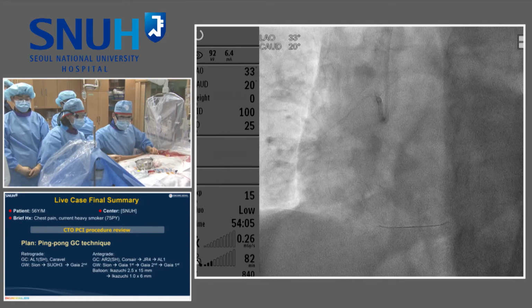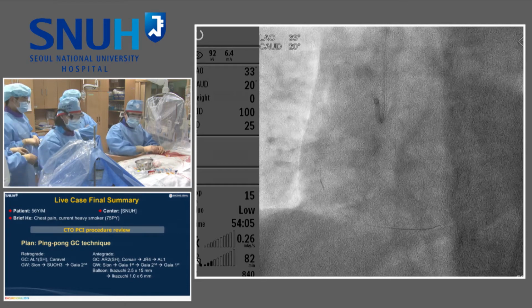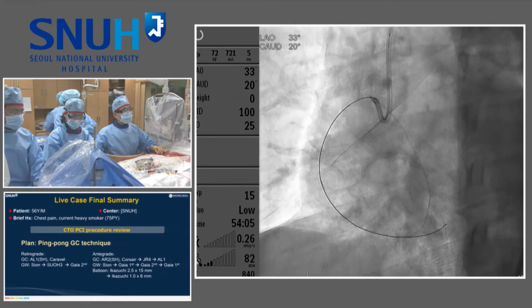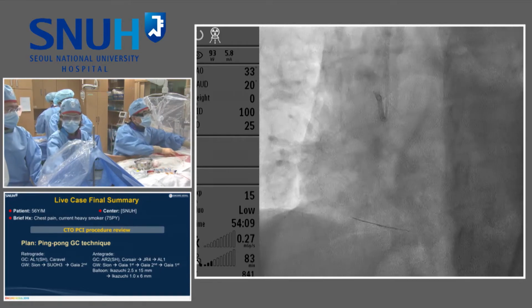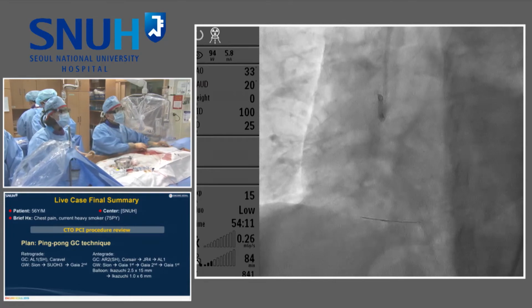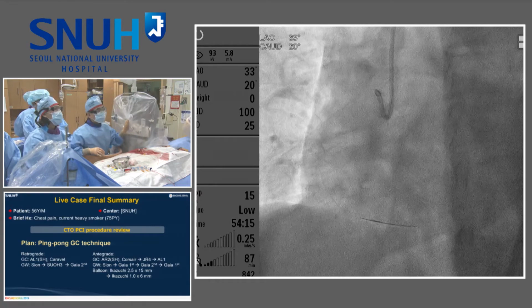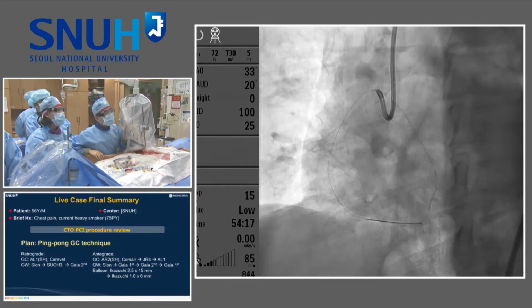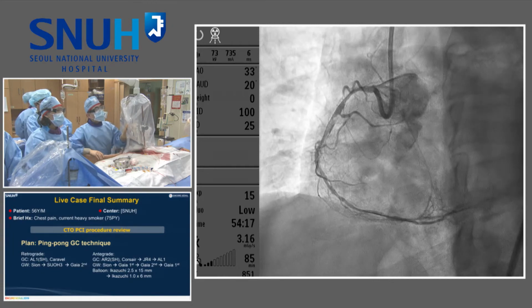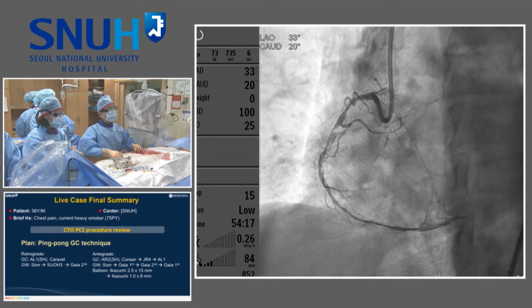Okay, I exchanged the soft wire, Gaia to soft wire, and once again, we try to take a picture. Okay. 살짝 테스트 해볼까? Okay. 자, 스냅. 3.5 longest. 3.5, 45.